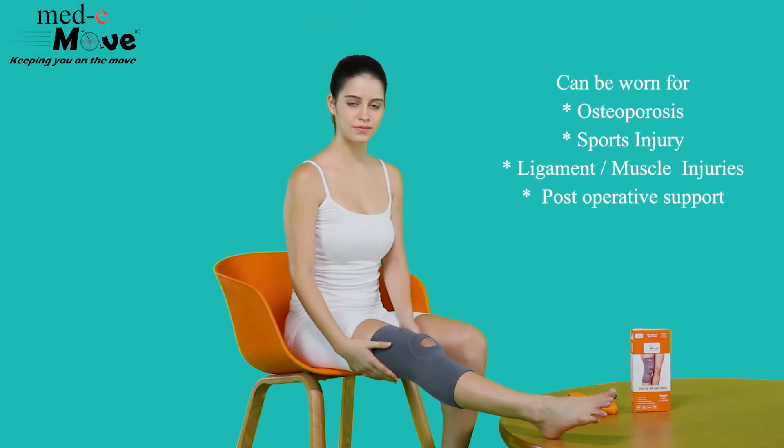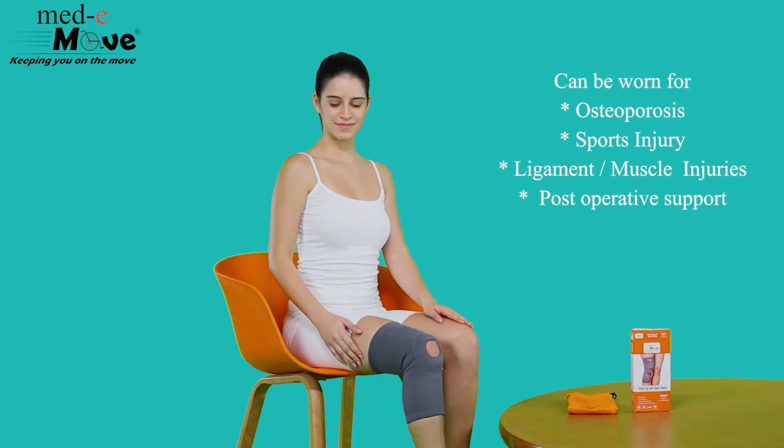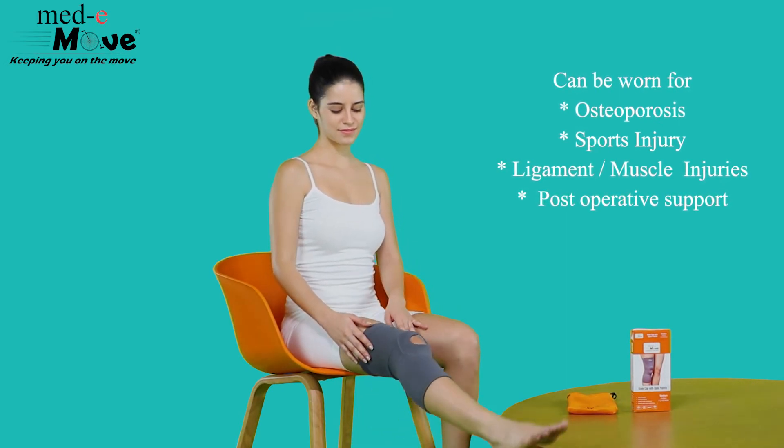The Medimove kneecap with open patella can be worn for osteoporosis, sports injury, ligament and muscle injuries, and for post-operative support for the patellar region.